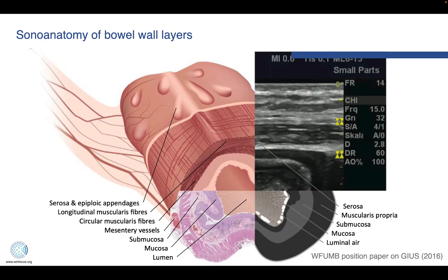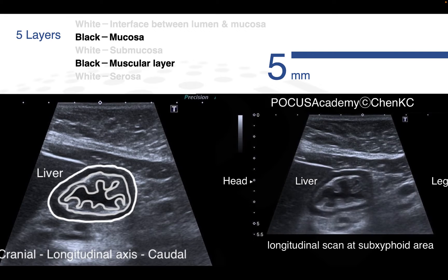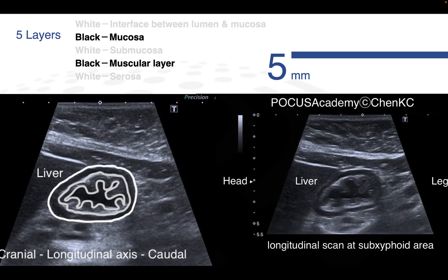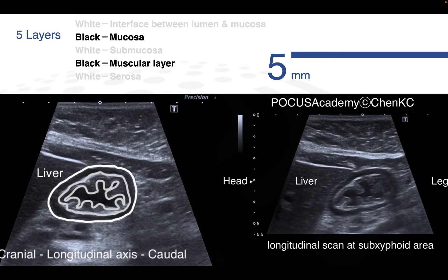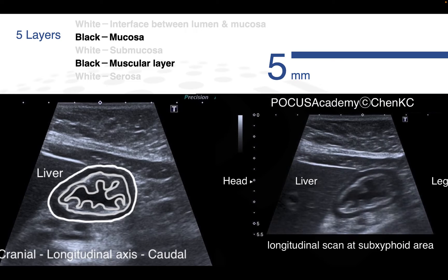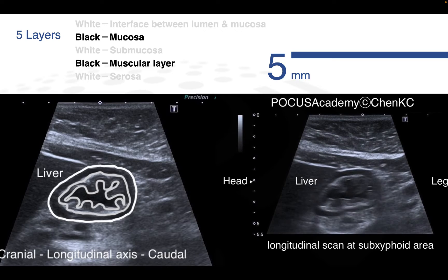For the well-known anatomy of bowel wall layers, we should understand that normal bowel walls contain five layers, especially when you use high-resolution linear transducers. These five layers become much clearer — three bright hyperechoic layers, two anechoic layers. The wall has its normal size; when the size is greater than five millimeters, it is always abnormal.